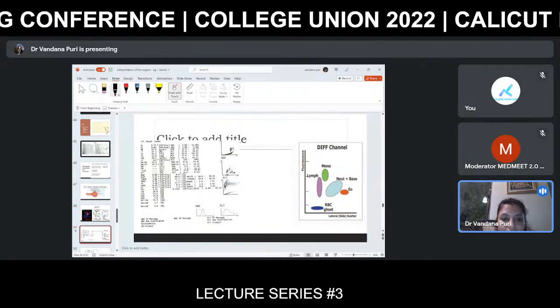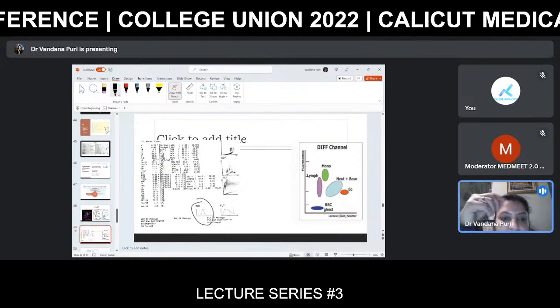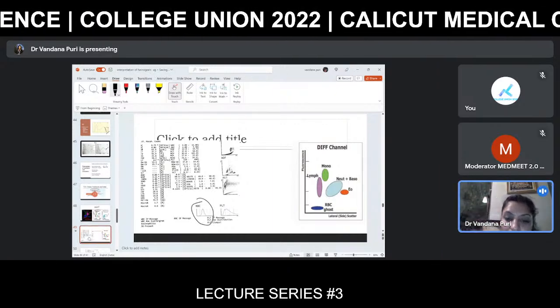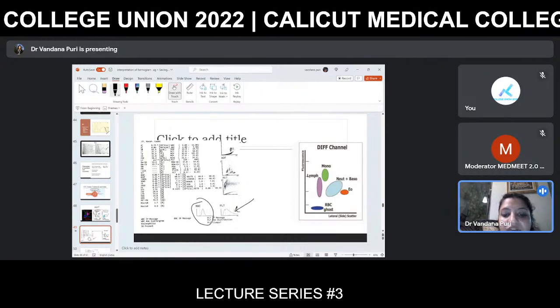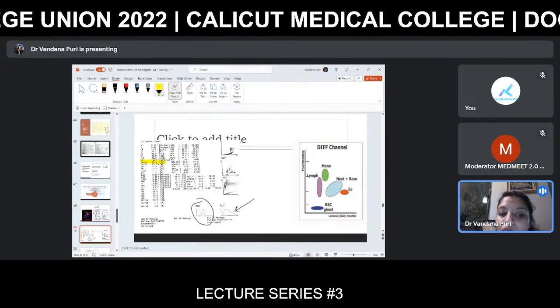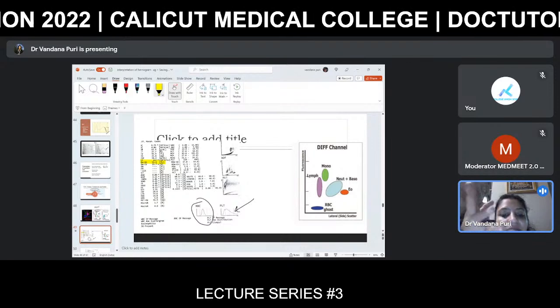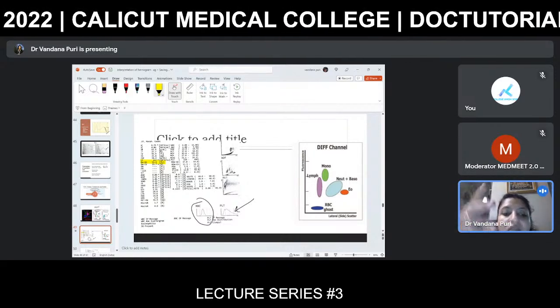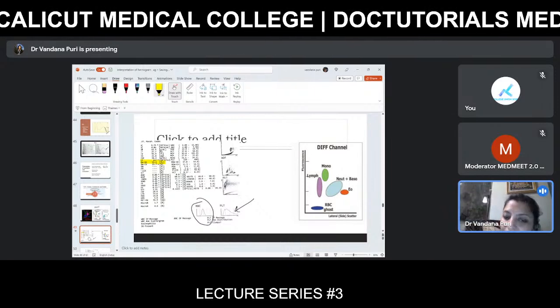Look at this Coulter, guys. If you look at it, the RBC is very clear. You can see the RBC curve here. It's normocytic normochromic. Can you see the platelets here? Multiple peaks. That means there are definitely platelet clumps. You have to see the platelet count of this patient. It was 1,17,000. But you can see the number of peaks here. So there must be some platelet clumps, and you will definitely go and see the smear. It will usually show you platelet clumps.